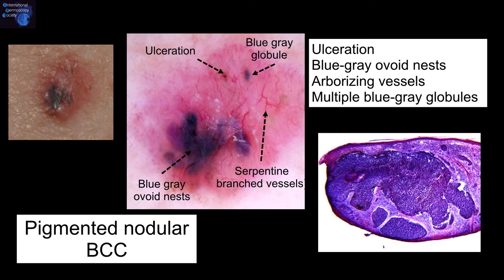This is another example showing a pigmented nodular basal cell carcinoma with a blue-gray globule, an ulceration, serpentine branch vessels, and a blue-gray ovoid nest.